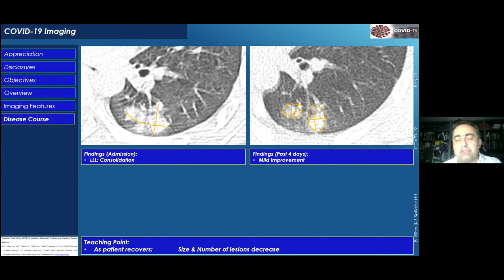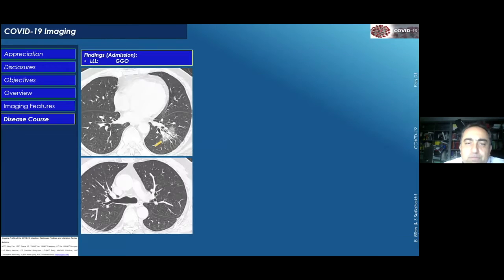We should not only check the size of the lesion, or only the number. We have to also pay attention to the architecture and the context of the lesion itself. So in this case, it would be misleading if I say that previously 1 lesion, now there are 2 lesions. Well, these 2 lesions are much smaller than that 1 big lesion.